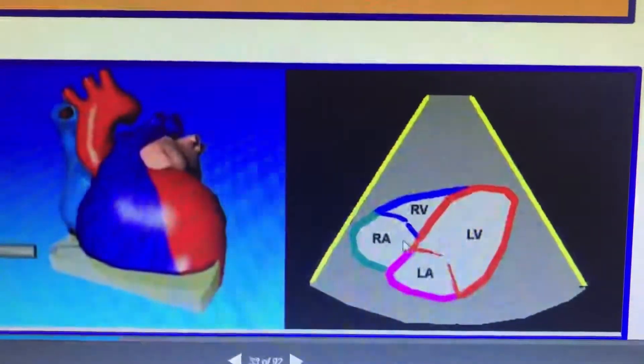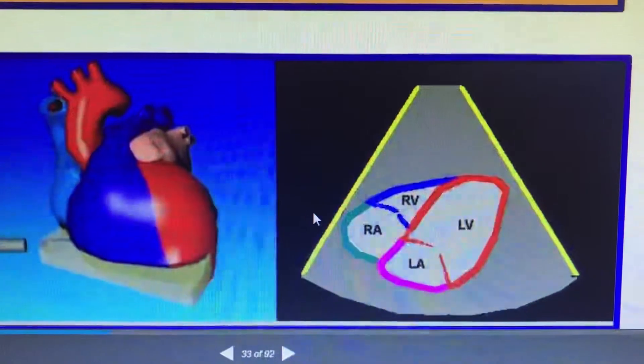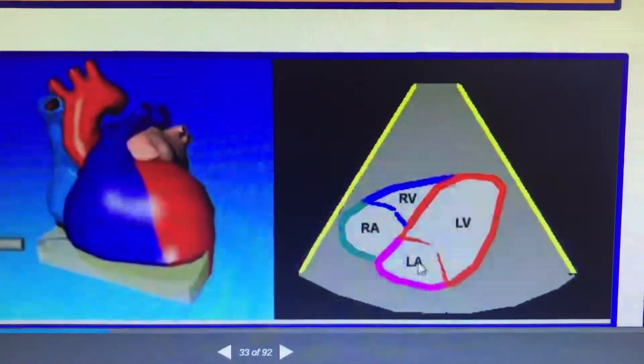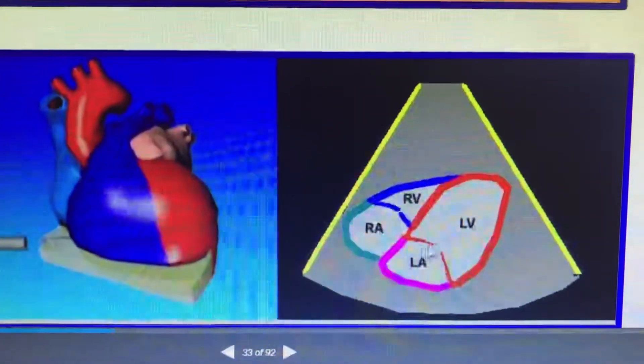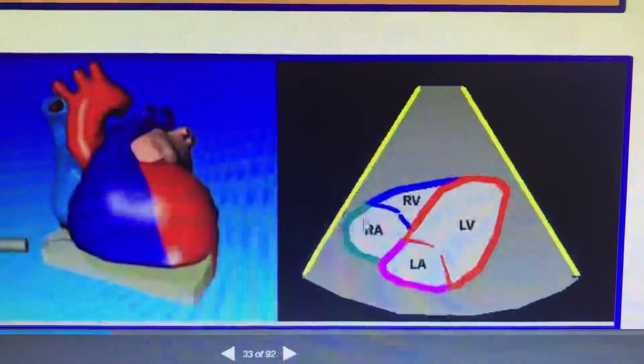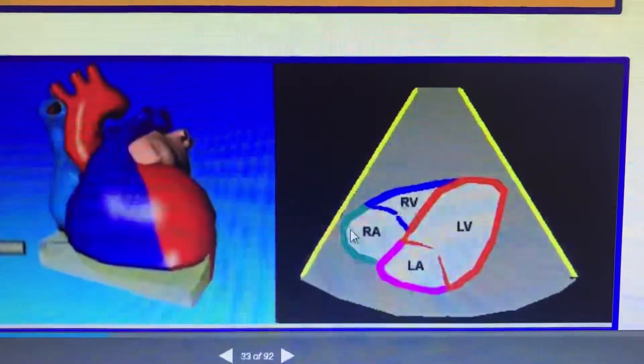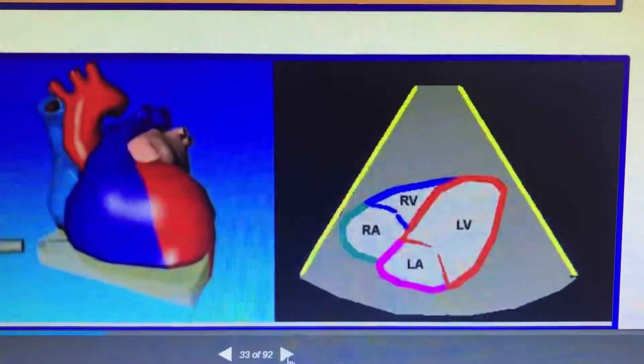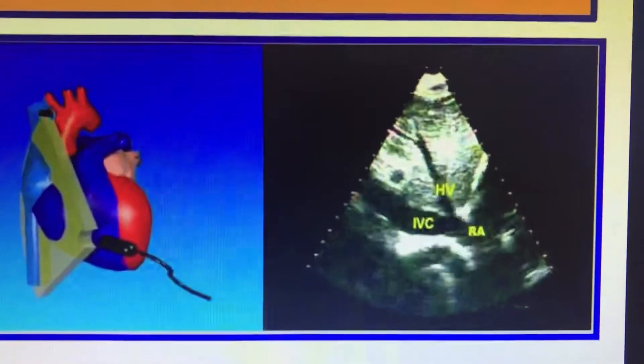This is the position for congenital heart disease assessment because you start from the IVC, RA, RV, then LV. Also, in emergency situations, this is the position where you will be seeing IVC dilatation and the response to respiration.